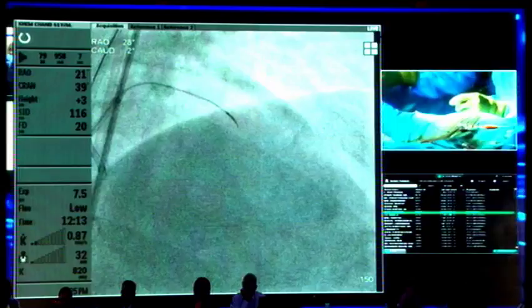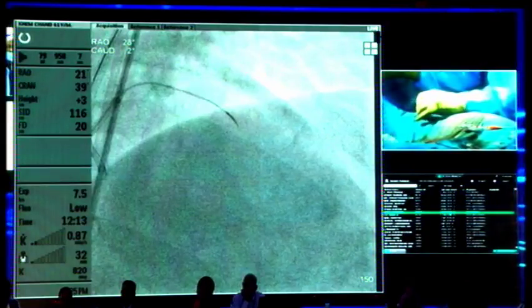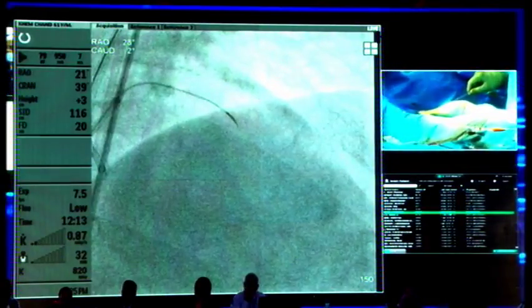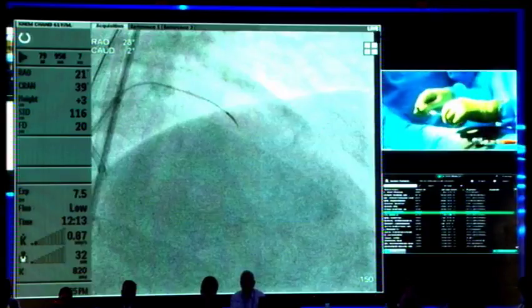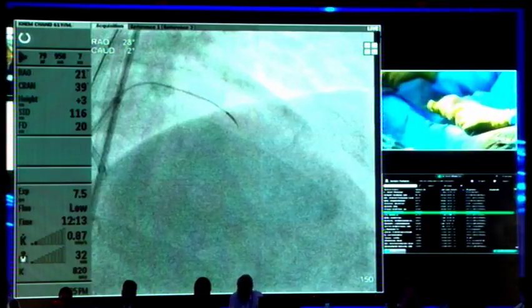I was saying that now we are already across the lesion. We can take any coated wire now. If the distal wire is small... No, actually, even though he crossed the lesion, we are thinking that the wire is going into small branches. He wanted to be clear that the wire is in the distal part, the distal lumen. I am sure that the microcatheter is in the center of the vessel. Once you go with this wire, you can take any wire.